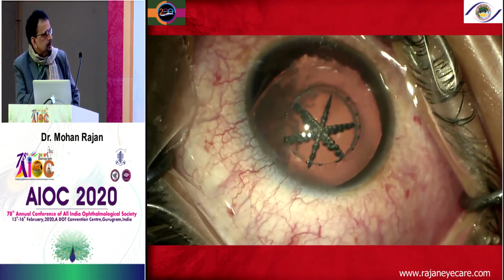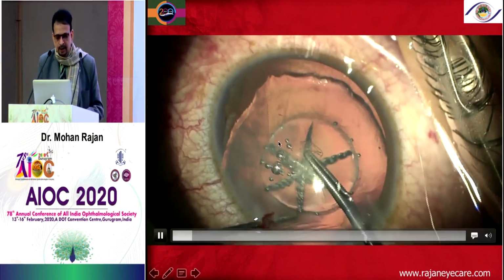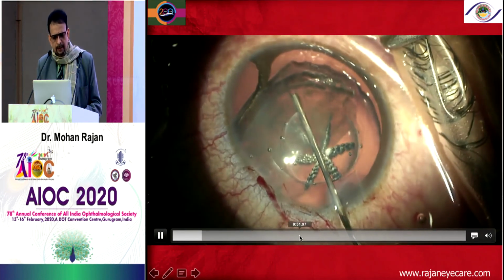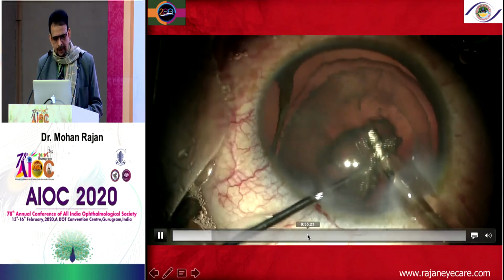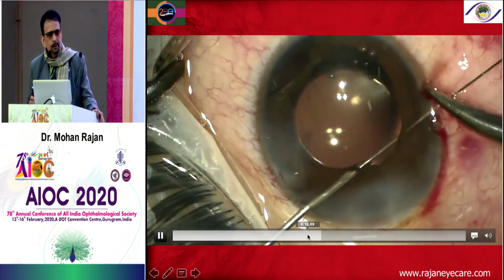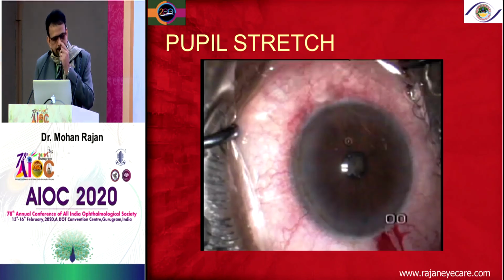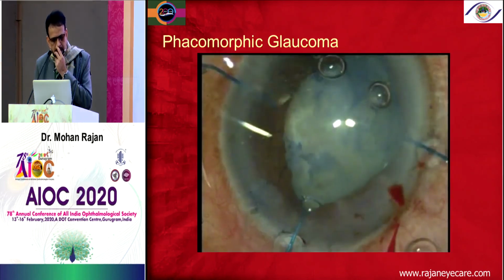And see this zonular loss as well, and then I'm going ahead with the femtorhexis. The patient had traumatic mydriasis. You can see the iridodialysis also in the inferonasal quadrant of this patient. So I went ahead and did a CTR, and then what is called a single pass four-throw pupilloplasty. It is a very simple technique which has been devised by Amar. So I will not go through all these other things. I think it's very exhaustive as well.